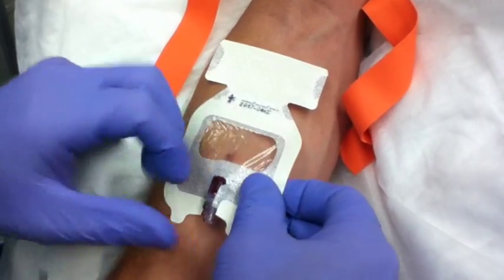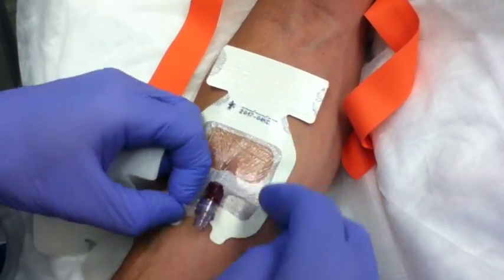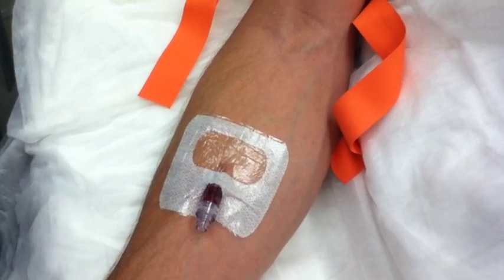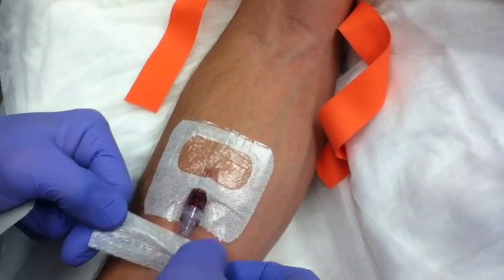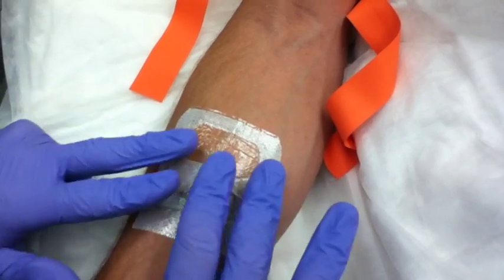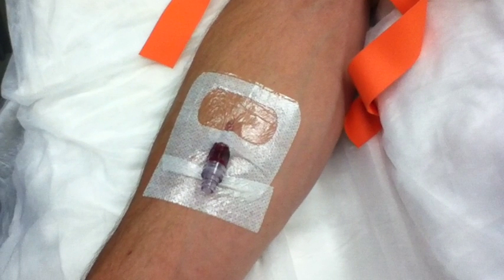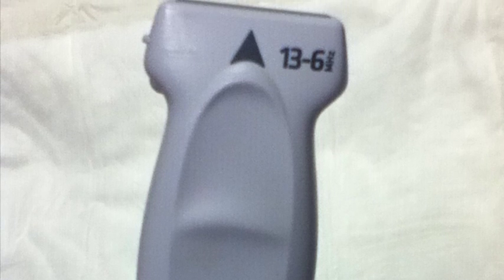They have little tegaderms with a window that shows the color of the hub so you can see it easily, and also lets you see distal for the IV. I prefer a lock strip underneath the part of the tegaderm to help hold it down. Sign and date the time, the size of the IV, and where it came from — EMS versus ours — so everyone is aware. That's a peripheral IV in a nutshell. Not all patient arms look like this, and when a challenging situation presents itself, I turn to ultrasound.